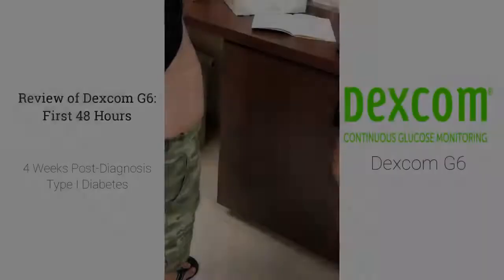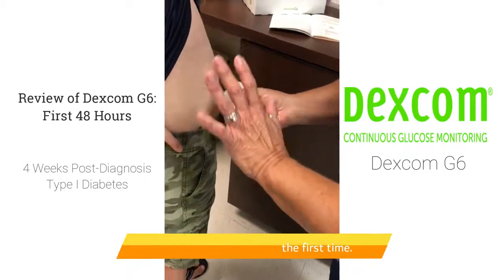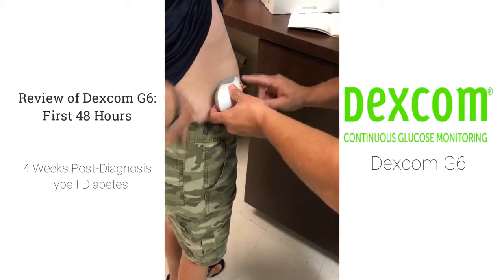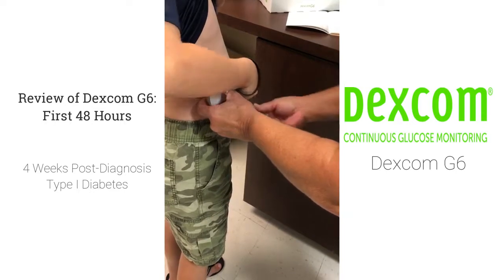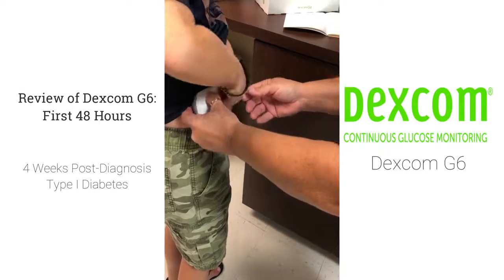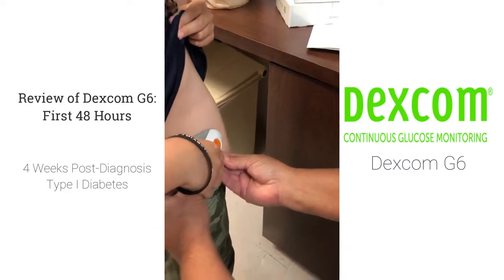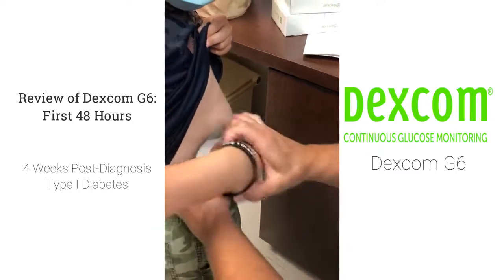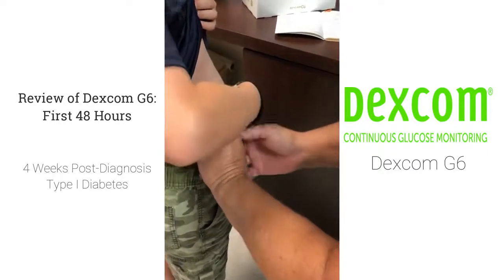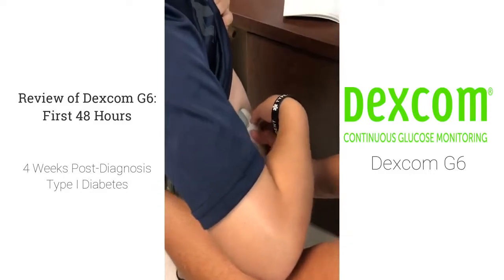Go this way so you can bend with it. So which way — we'll do this way? Either way, I'm just going to stick it on you. Okay, we're going to stick it. Break this piece off. Just hard, really hard. Here, let me do it. Just go like this, you're working too hard at it. See? That's it. Don't push just yet. Now, when you're ready, push that button — you're going to hear a spring. It's not going to hurt, I promise. One, two, three. Hit it.